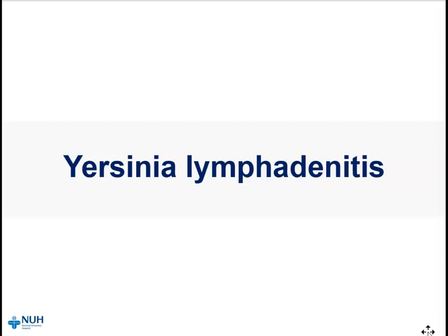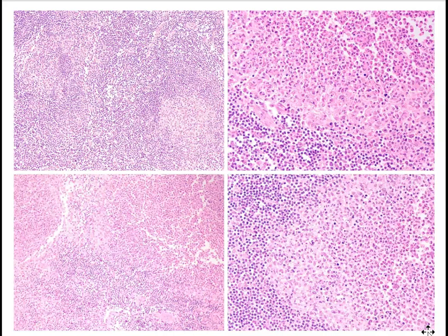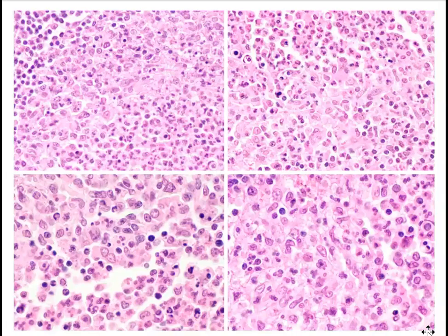This is another example of necrotizing granulomatous disease. On microscopic examination, we can see multiple microabscesses featuring collections of neutrophils and necrosis that are surrounded by aggregates of epithelioid histiocytes. Higher magnification shows central necrotizing foci with numerous neutrophils and peripheral aggregates of histiocytes.